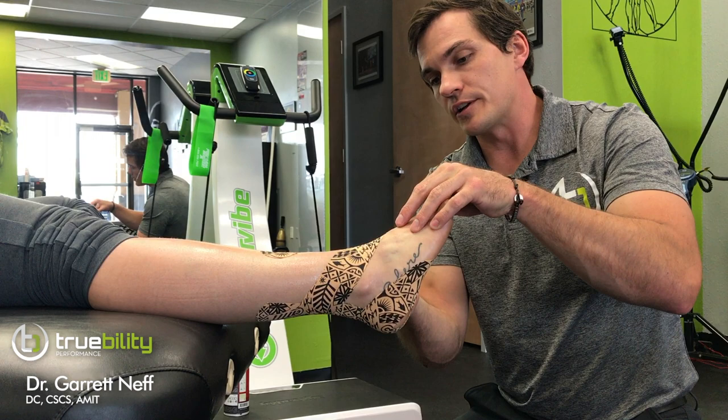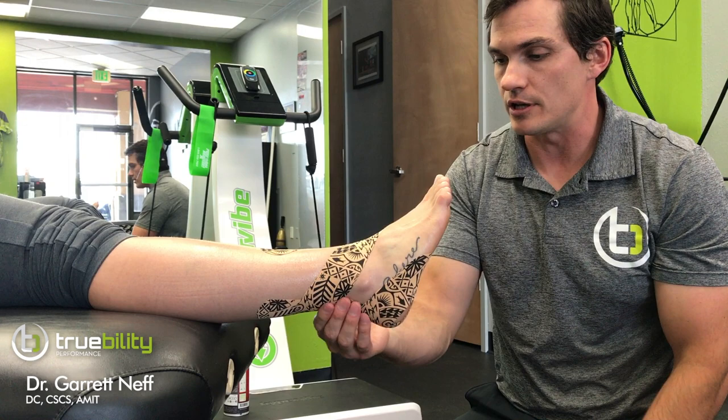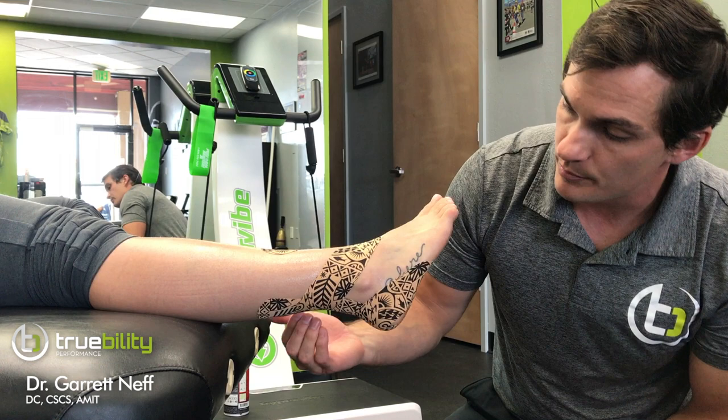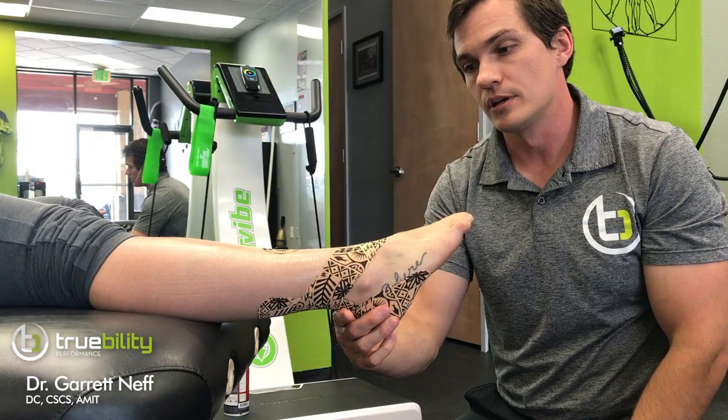The combination of the Achilles offload, feedback, and inversion moment at the calcaneus should give her a little offload of the lateral Achilles where she's experiencing pain. When she gets up, she feels like it's a nice bear hug, and it's much easier for her to get through those rear foot gait mechanics.